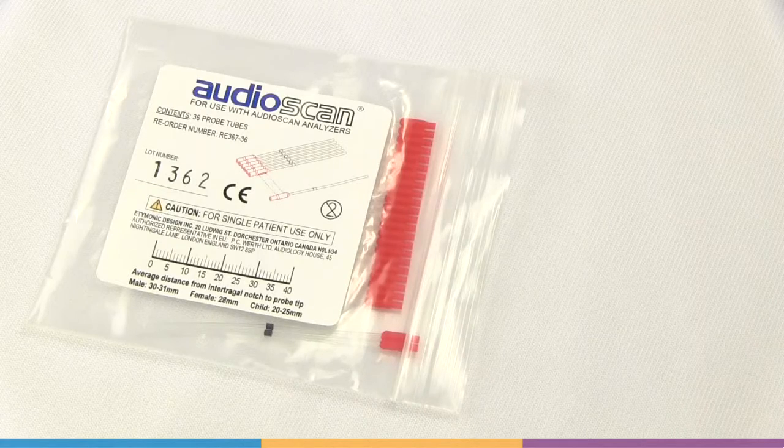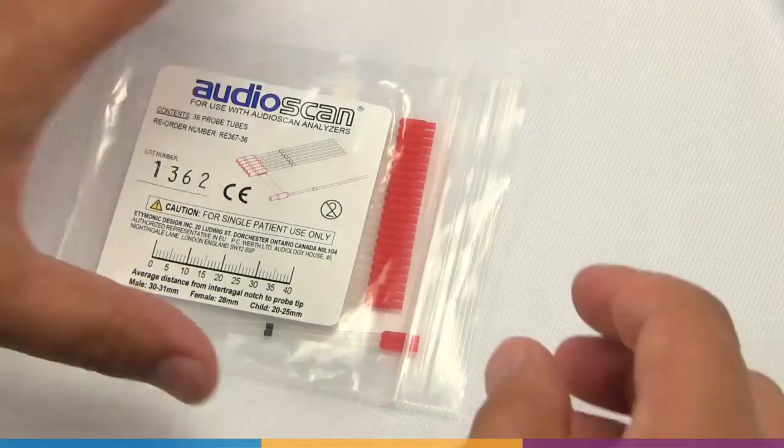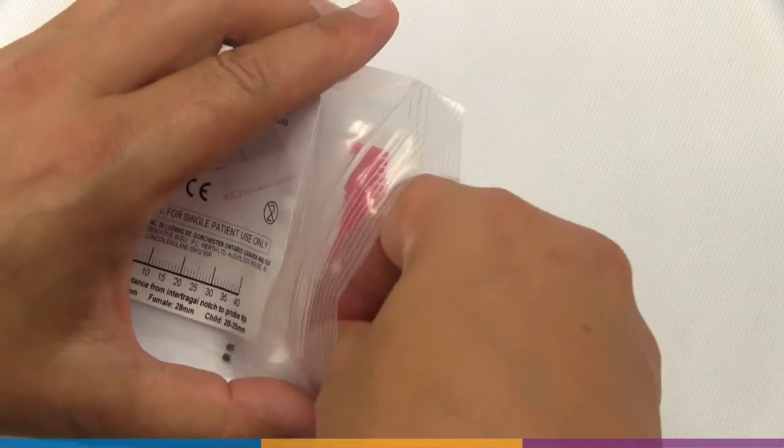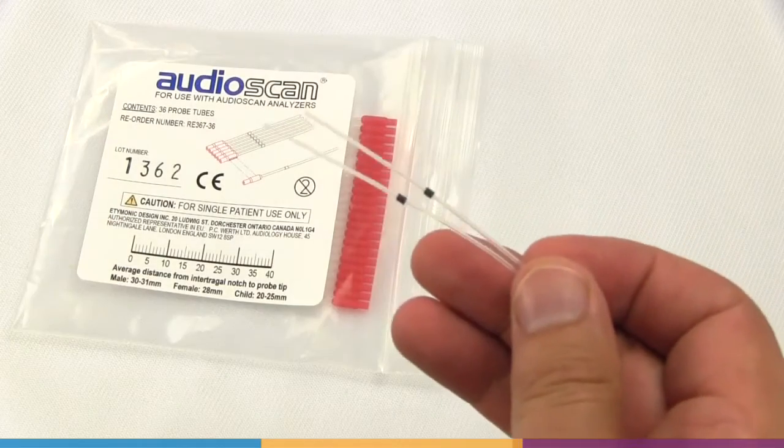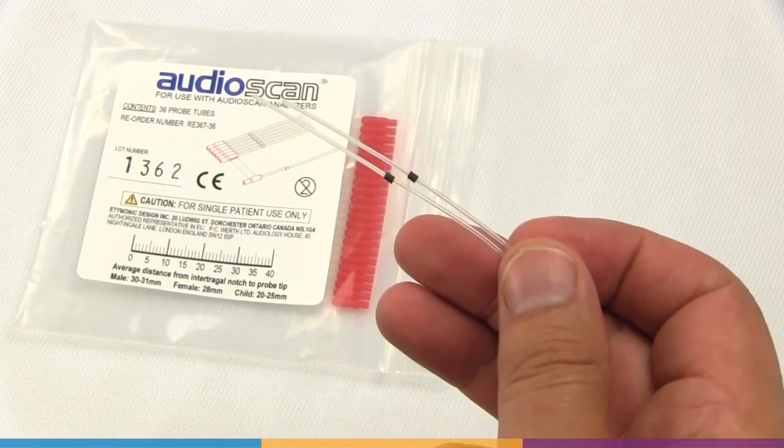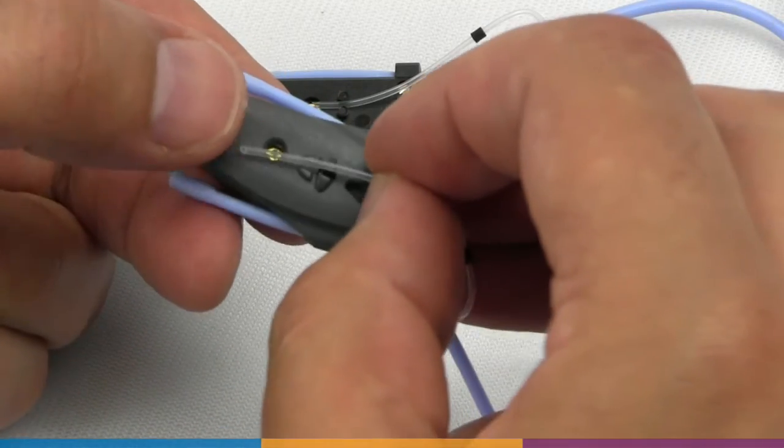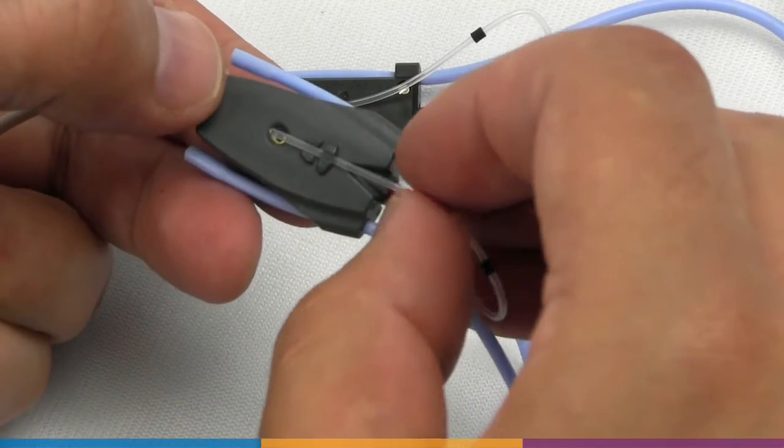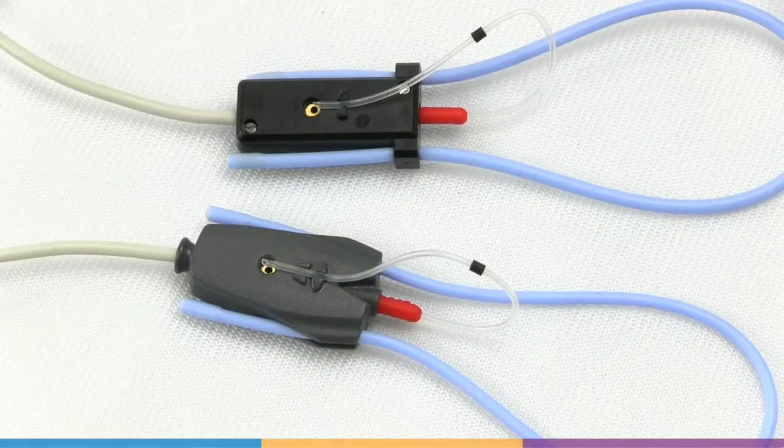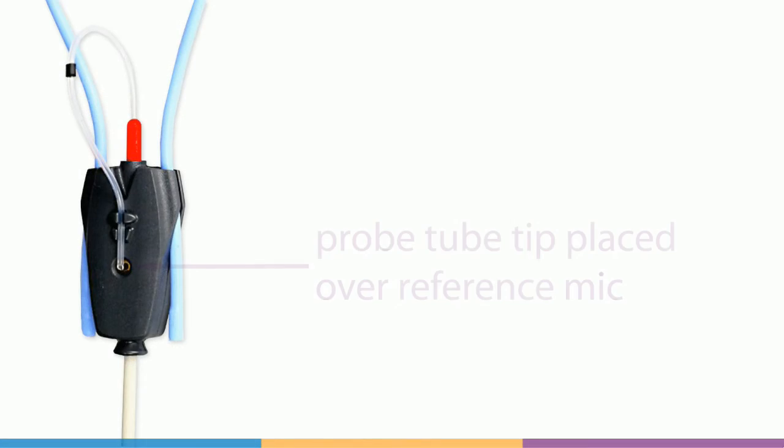Place a new probe tube on the probe microphone module. Do not attempt to sterilize probe tubes, as this process leaves residue which damages the probe microphones. The probe tube should be bent over and placed between the posts on the reference microphone side of the module. The tube must be positioned so that the tip is over the reference microphone opening.